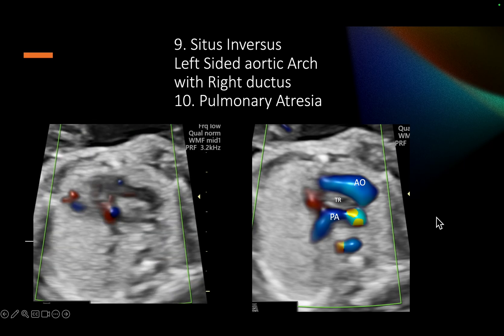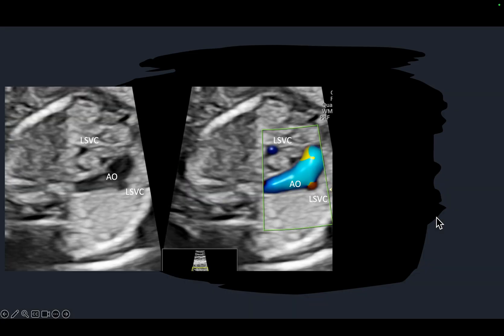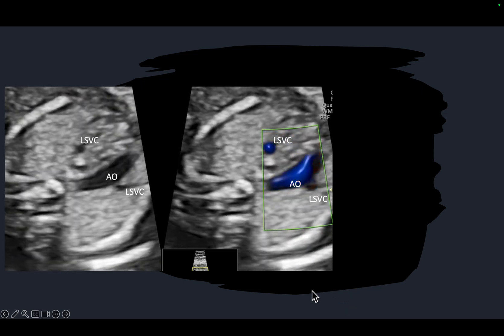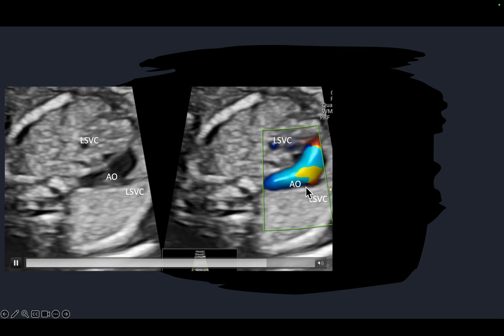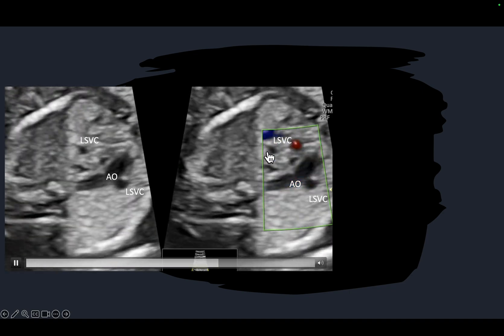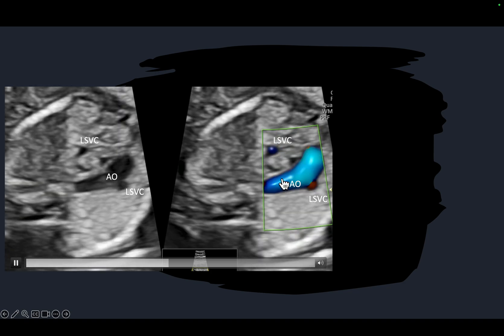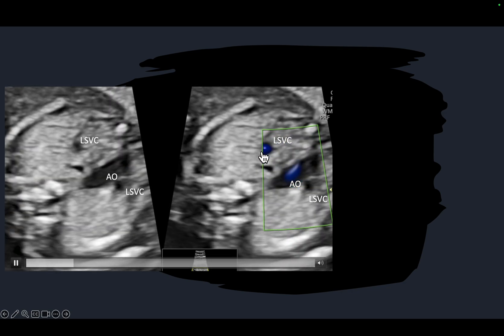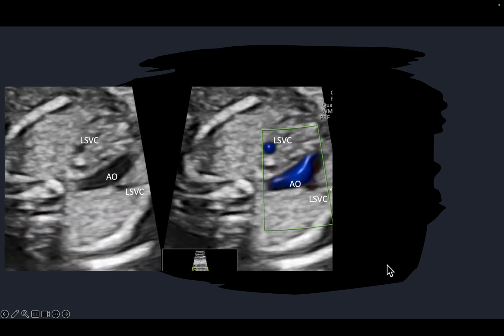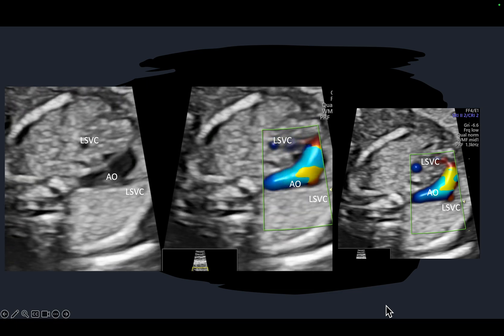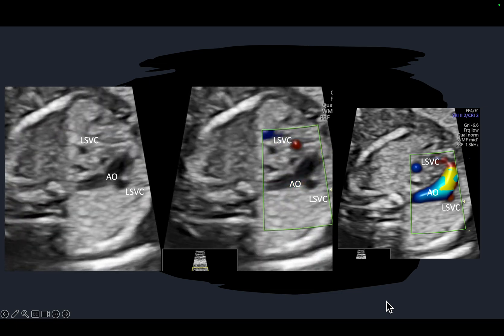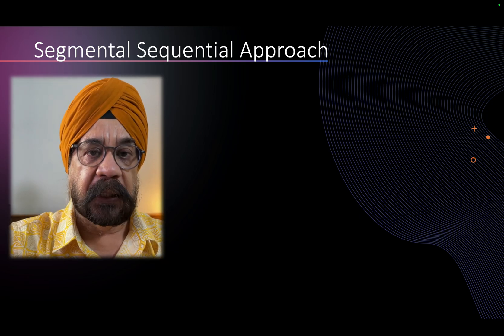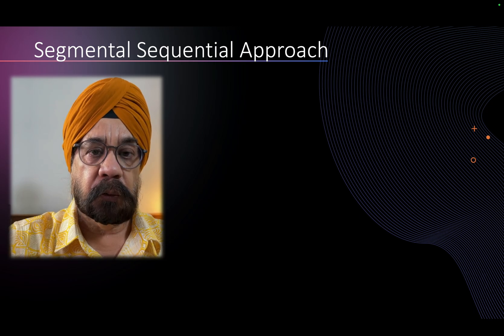Pulmonary atresia led to the retrograde flow of the pulmonary artery from the ductus. The last abnormality in this patient was bilateral superior venae cavae. This is the SVC on the right side, and this is the left SVC. Remember the aorta was on the right side of the trachea, so this was the right SVC and this is the persistent left SVC — bilateral SVCs due to persistent left superior vena cava.